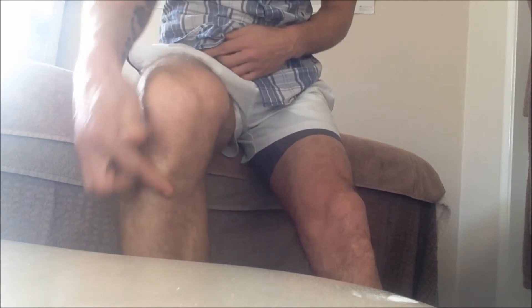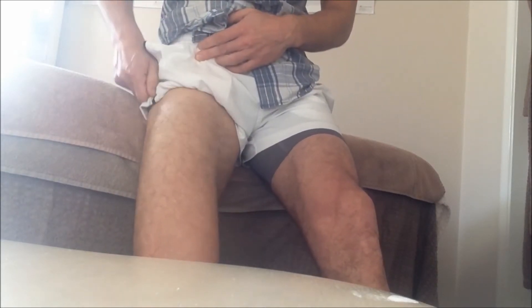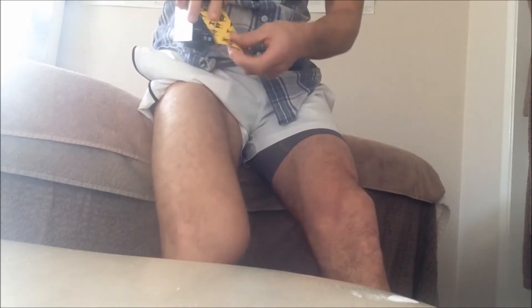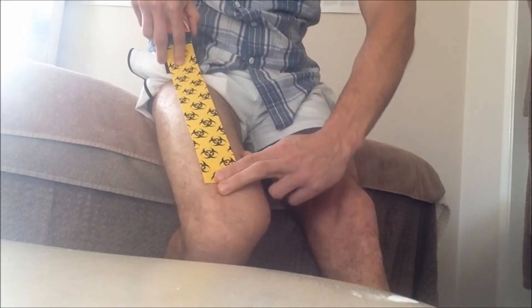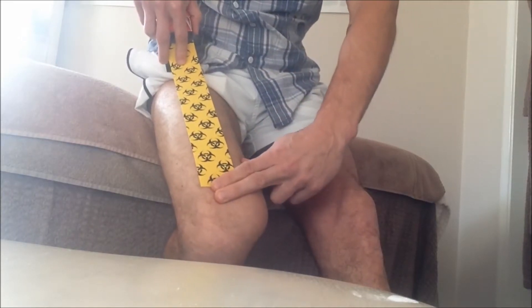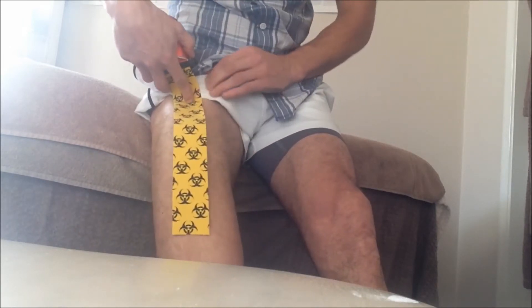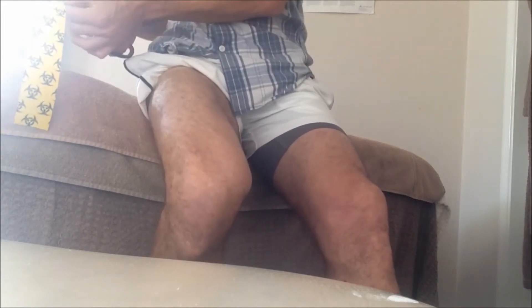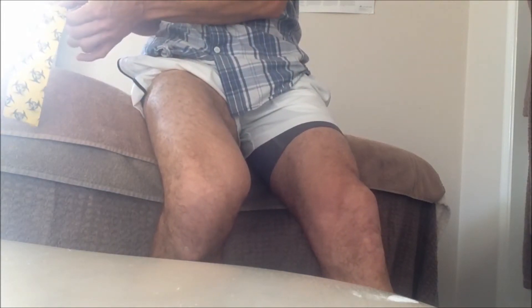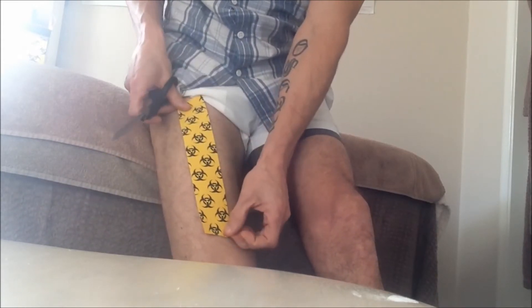Now we know where the muscle runs — from the AIIS all the way down — we can measure our tape. The first piece of tape should span from about the side of the quadriceps tendon, just two fingers or so above the bend in the knee, up to about a hand's width below where the AIIS is. We end up with a piece about this long, and just cut it off.